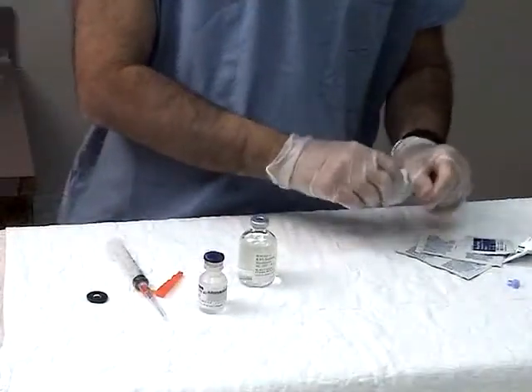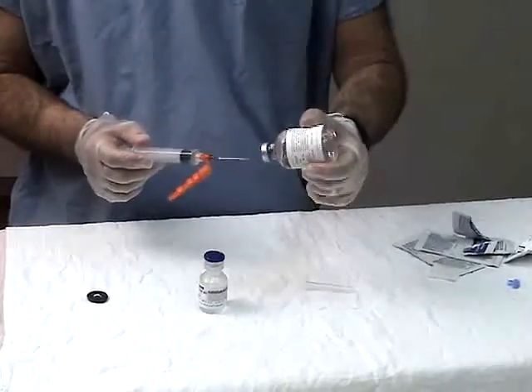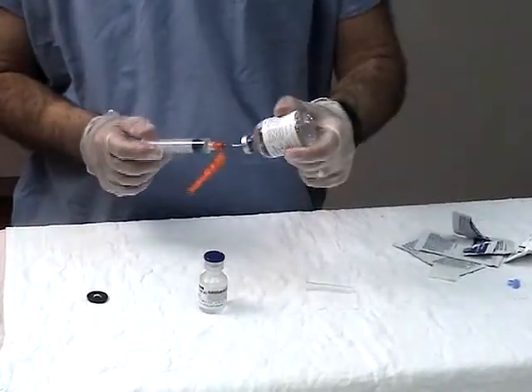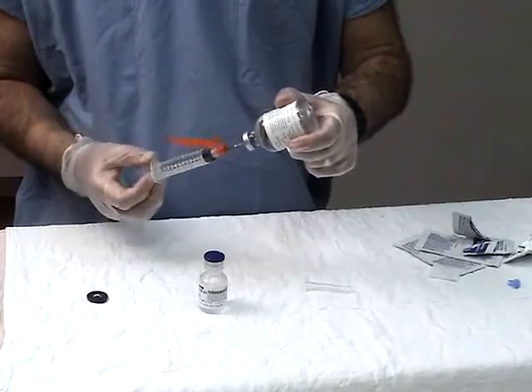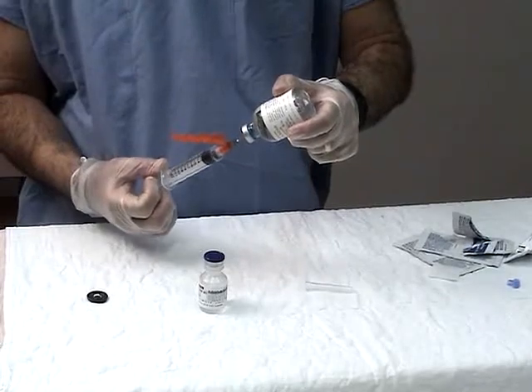When using a multi-dose vial, first cleanse the stopper with antiseptic and then invert the bottle. Inject air into the vial to facilitate removal of the agent and then withdraw the desired amount of medication into the syringe.